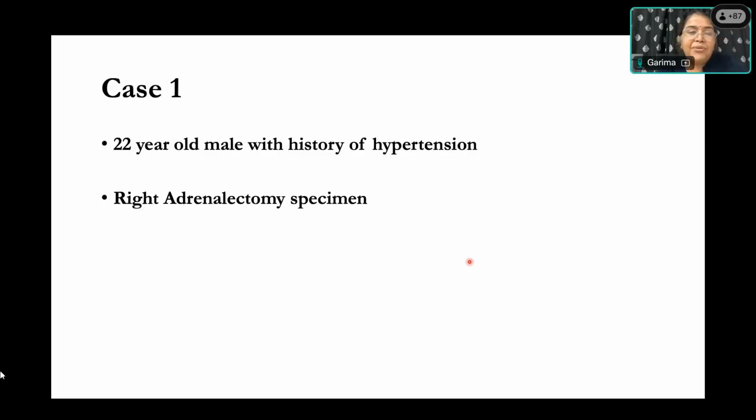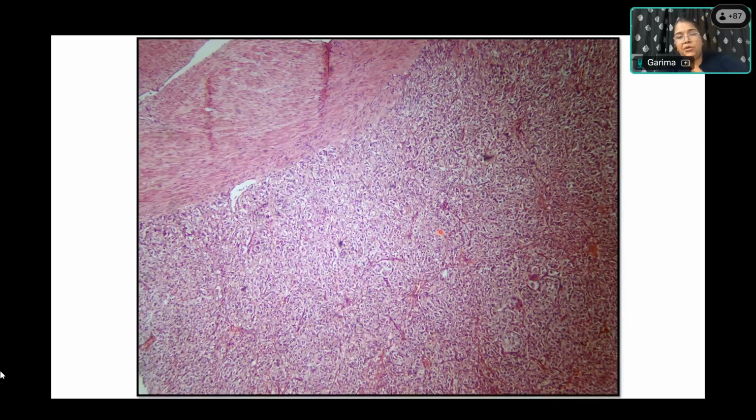Okay, let's come to the slide. This is the image that was provided to you. Dr. Hasti, can you describe this? What do you see over here? Anybody? Dr. Shweta, Dr. Srishti, would anybody like to volunteer? What are you seeing and what are we supposed to see? What do you think this is? One of the students can speak.